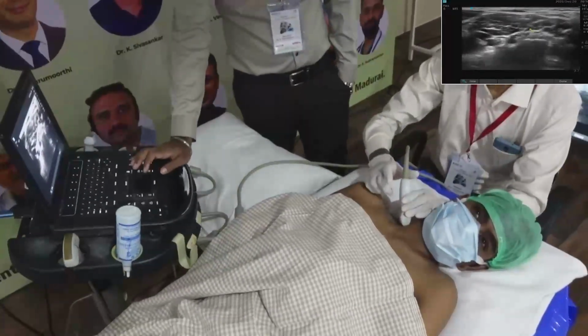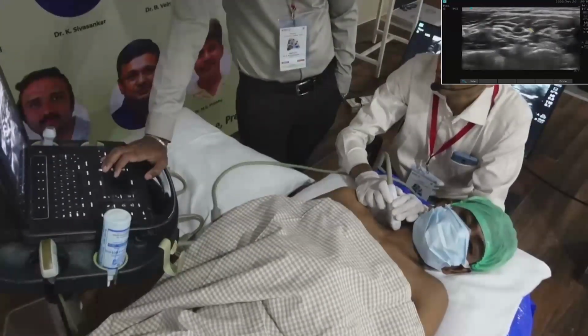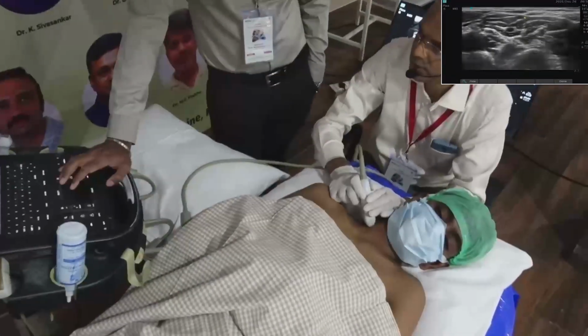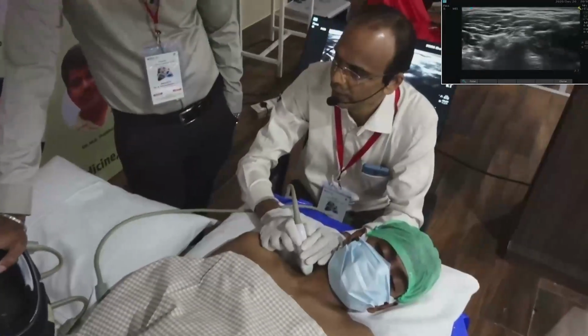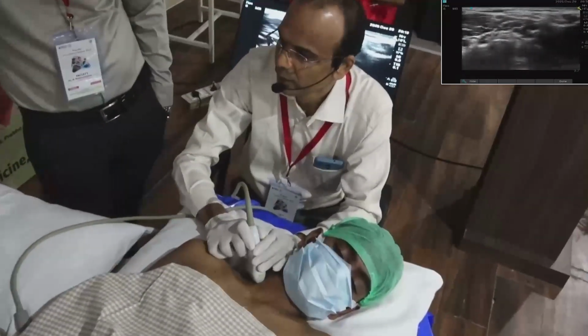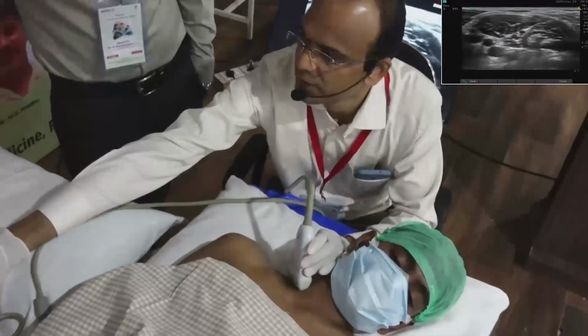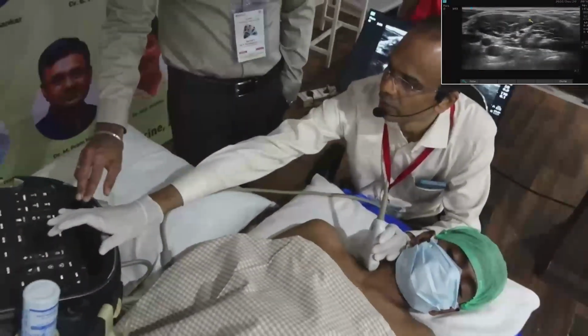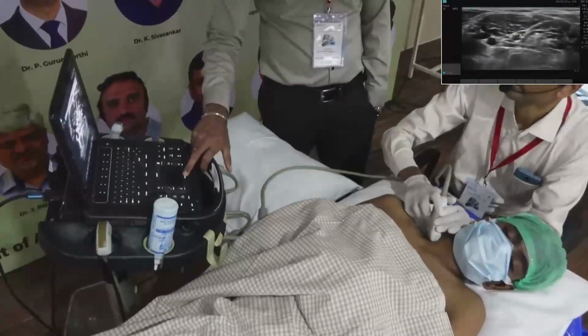So now we have finished the upper trunk. So roots, now it has become trunk. So this is the upper trunk, and this one, the middle trunk, is formed by C7.